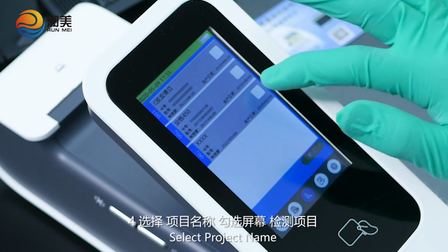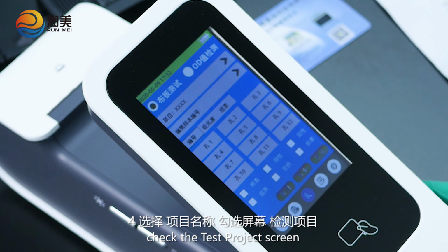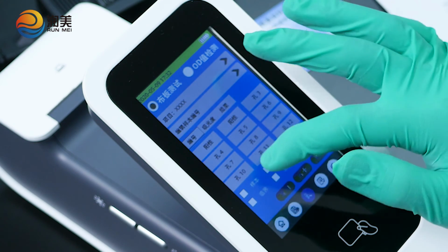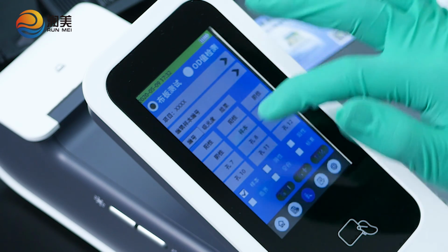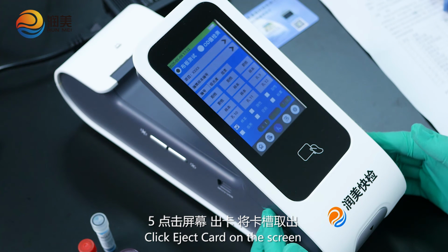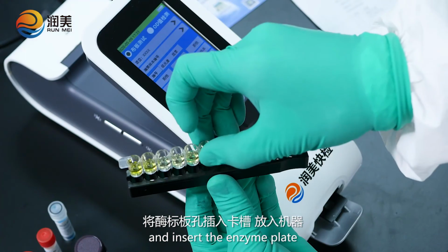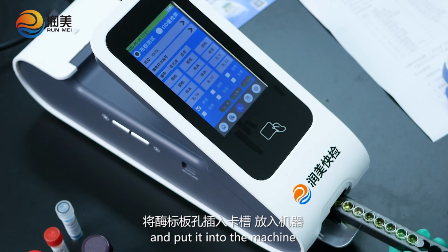4. Select the project name. Check the test project screen and click Confirm. 5. Click Eject Card on the screen, then take out the card slot and insert the enzyme plate into the card slot and put it into the machine.